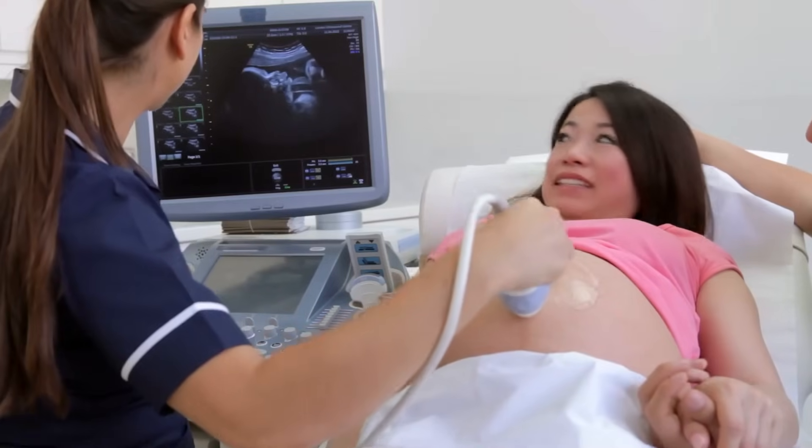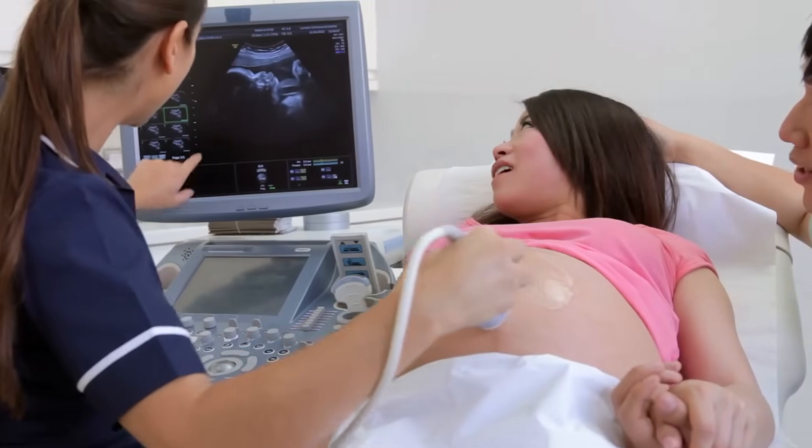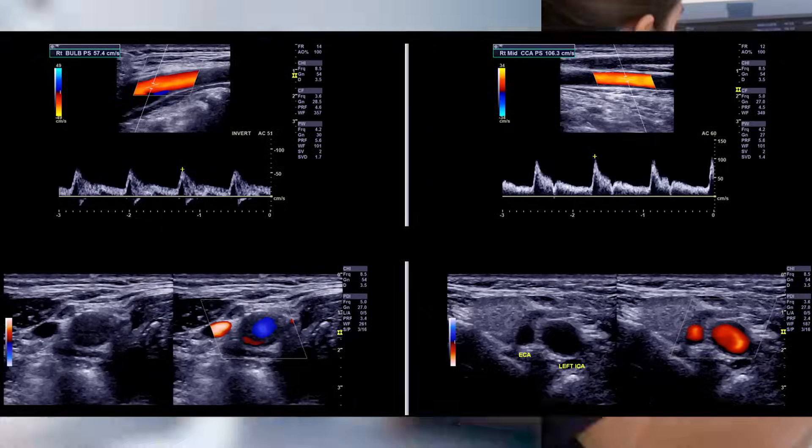These echoes are captured and transformed into real-time images on a monitor, allowing us to see the structures and movements of your body's internal organs. It's particularly great for examining soft tissues and blood flow, making it a go-to exam for obstetrics — looking at a growing baby in the womb — and abdominal imaging. If you've ever had an echocardiogram, it's basically an ultrasound of your heart.